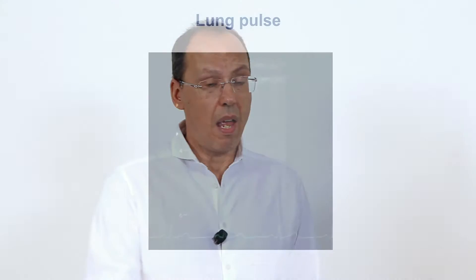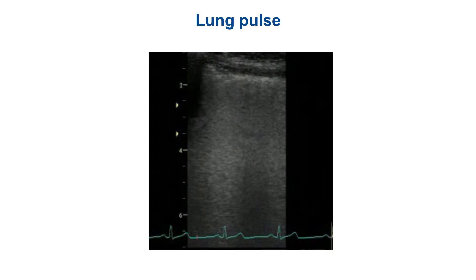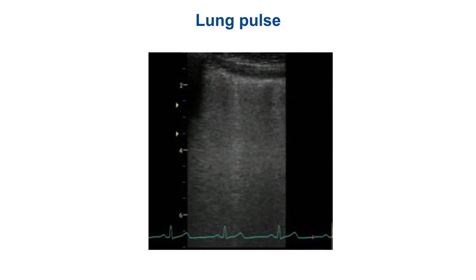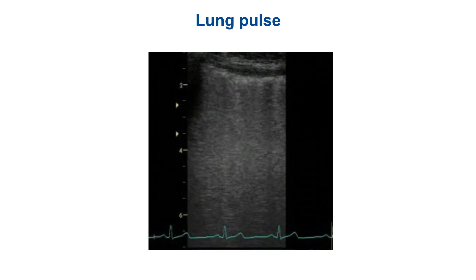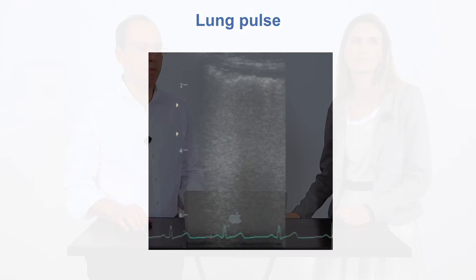Hi everybody! Do you know what the lung pulse is? Giovanni, could you tell us what it is? Of course Luna! The lung pulse is an important sign in lung ultrasound. As you can see, it is a movement of the lung that is synchronous with the heartbeats.